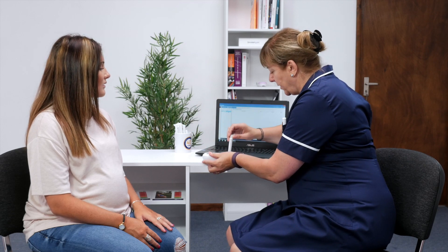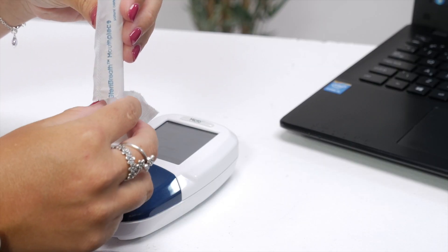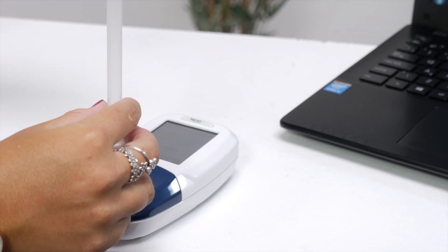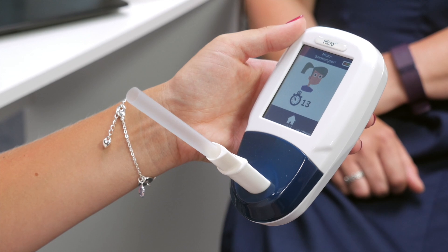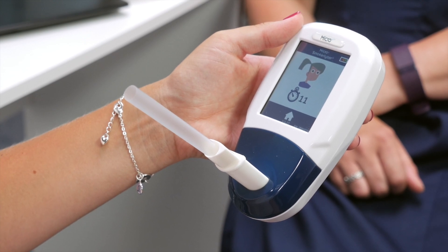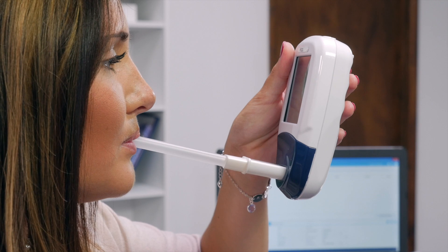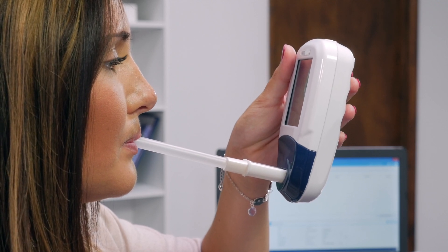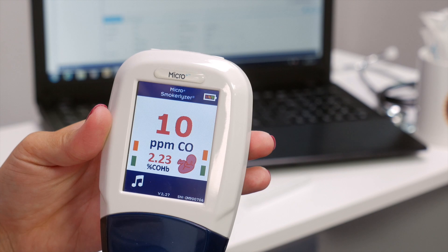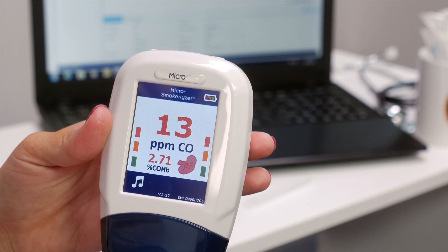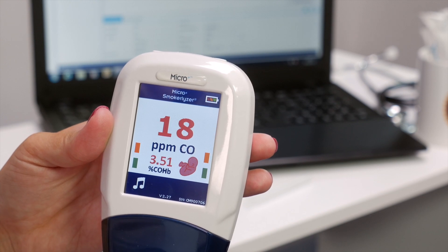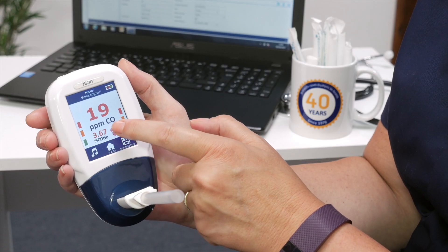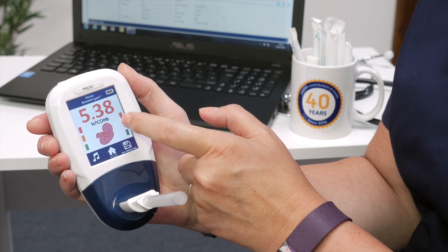To take a maternity breath test with the Micro+ Smokerlyzer, first attach the D-piece to the monitor and then the Steribreath to the Micro. Click on the maternity breath test icon to begin. You will be asked to inhale and hold your breath for the preset 15-second countdown before slowly blowing into the Micro. The reading will rise and stabilize on screen, and you can choose to mute the monitor if necessary.